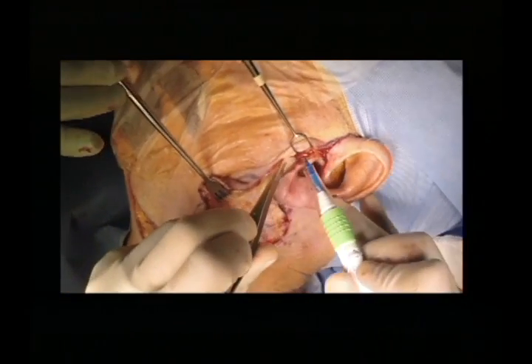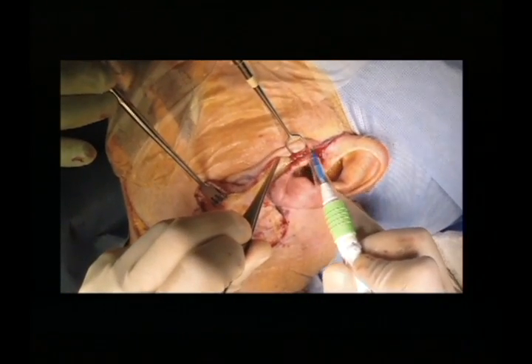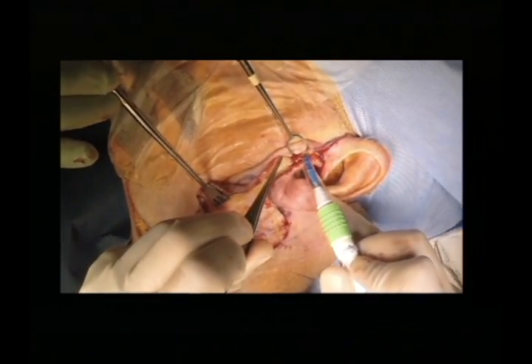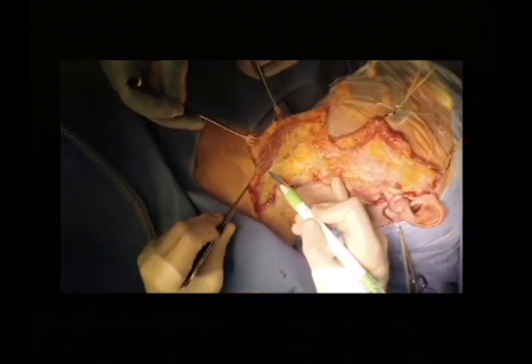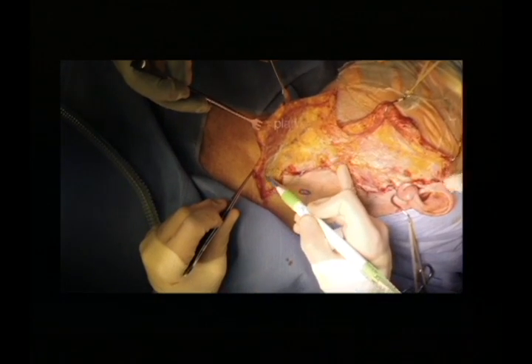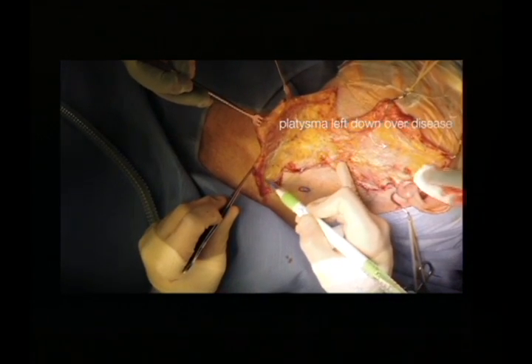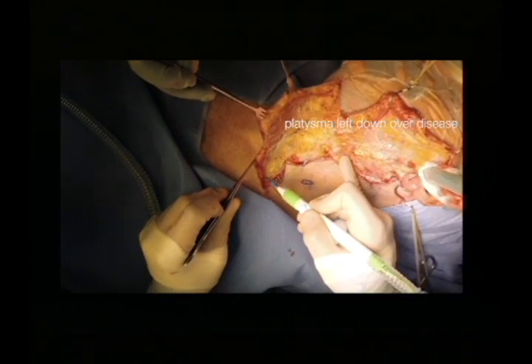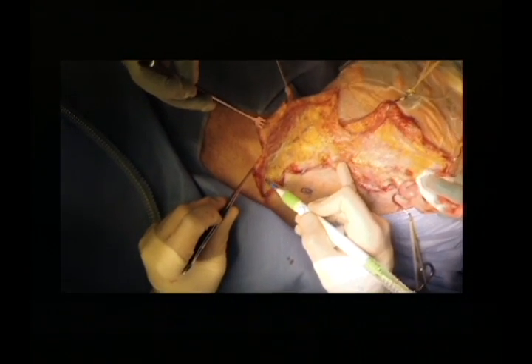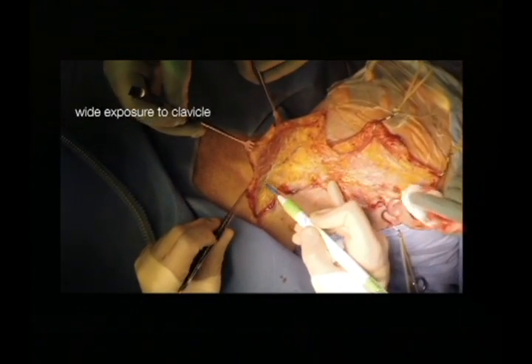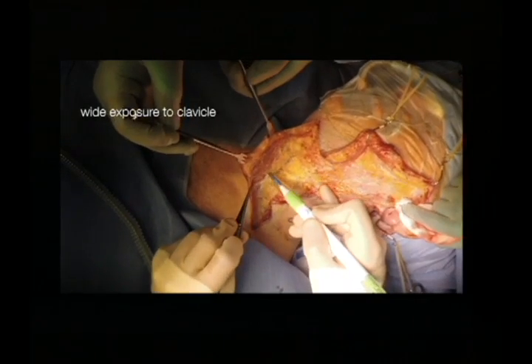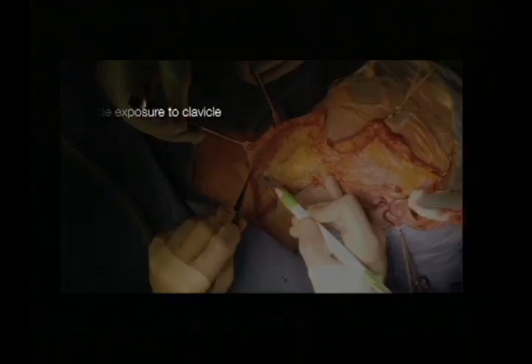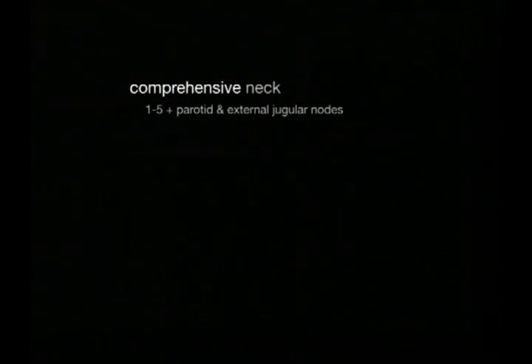We won't necessarily go for the main facial trunk. We'll come retrograde from anterior to posterior, chasing the nerve along. We do a wide exposure to make sure we can clear the low level 5 nodes, particularly in metastatic skin.